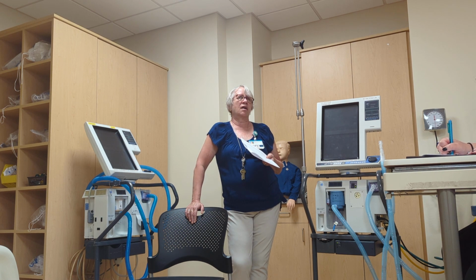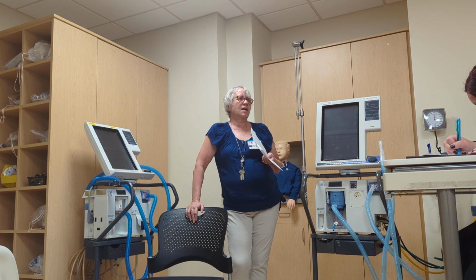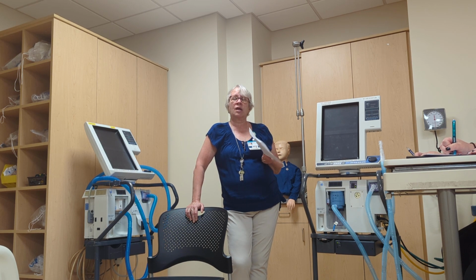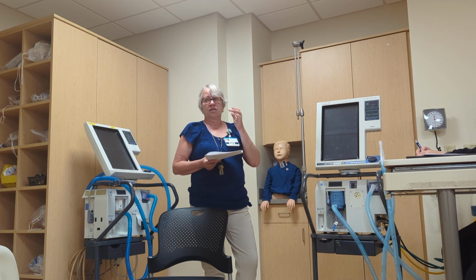We don't change circuits very often anymore. We used to do it every single day because they found if you take that patient off the ventilator, you expose them to an increased probability of getting VAP, ventilator-associated pneumonia. So we try not to take them off the ventilator too much. And we've moved to disposable, so it usually stays pretty dry. So RTs are responsible for that.